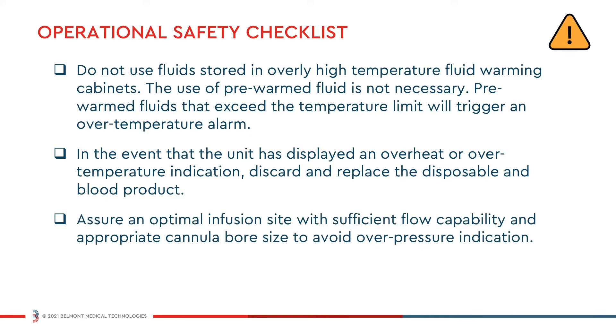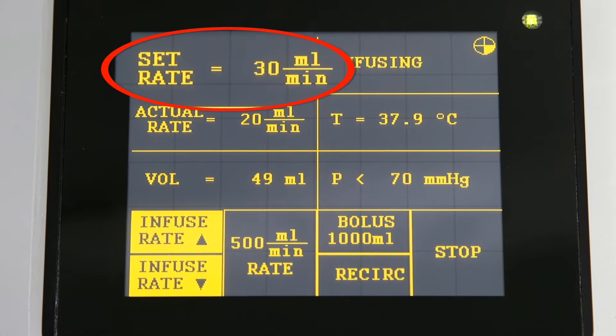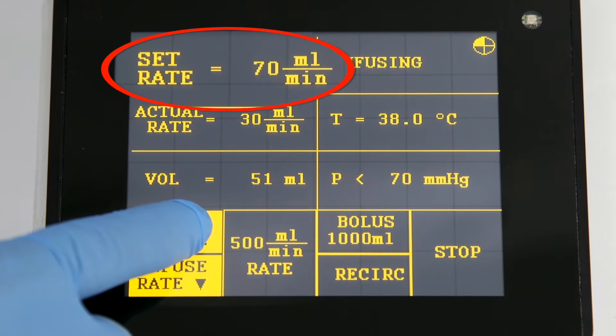Assure an optimal infusion site with sufficient flow capability and appropriate cannula bore size to avoid over pressure indication. Assure that bags have fluid in them. Press the up and down arrows to increase or decrease infusion rate.